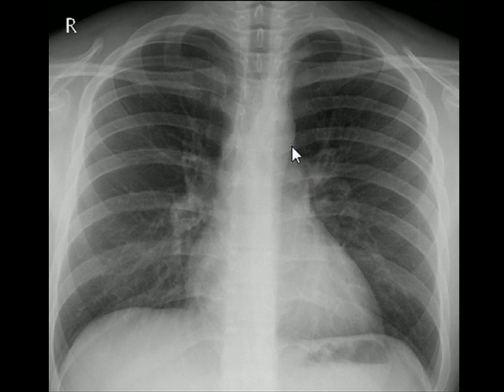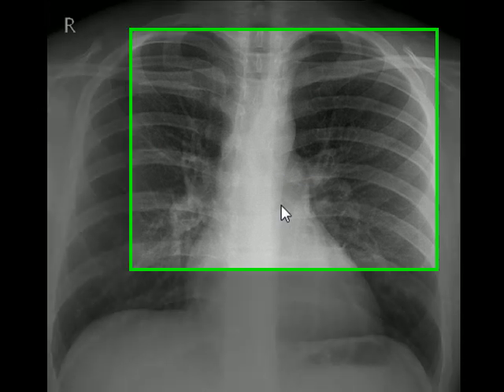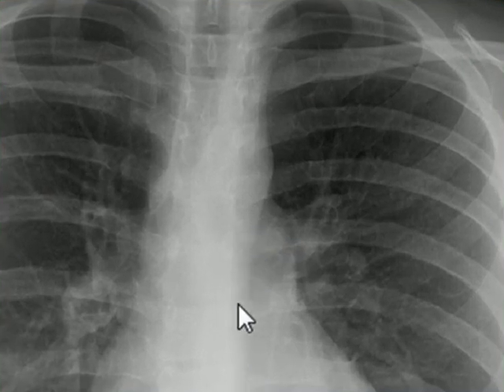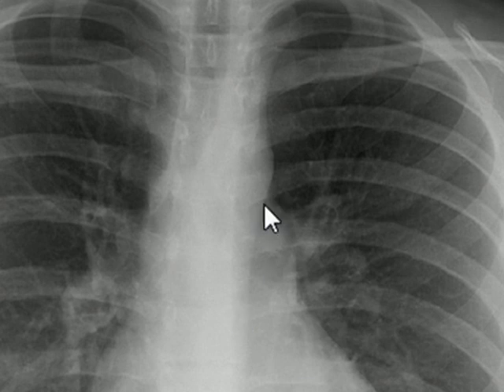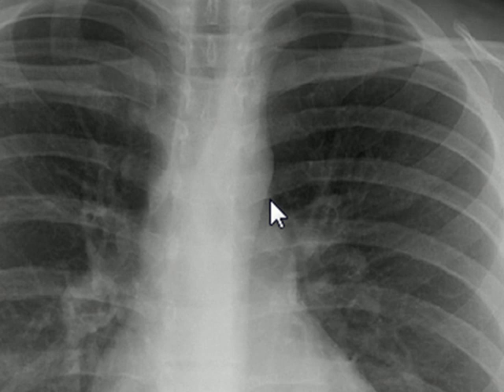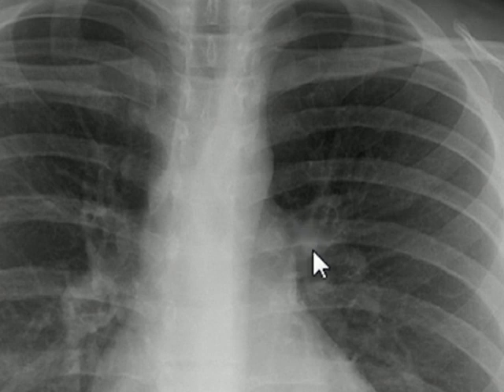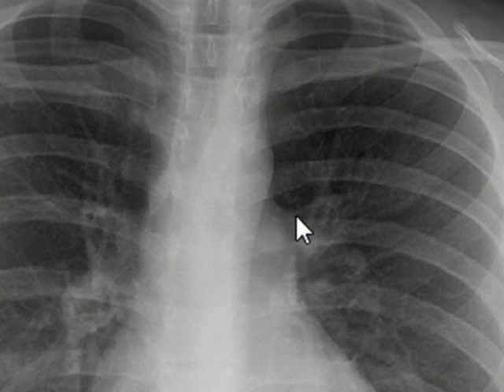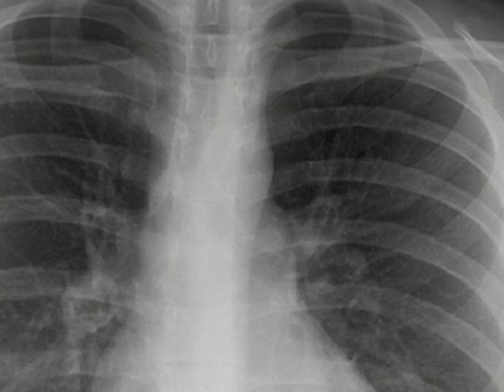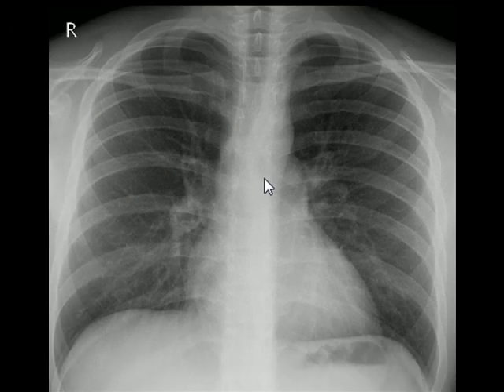This is the arch of the aorta turning into the descending thoracic aorta. This is the aortopulmonary window, which will disappear in the presence of any kind of mass lesion. This is the main pulmonary artery and this is the left pulmonary artery. The highest point of the left hilum is the left pulmonary artery as it passes over the left main bronchus. On the right side, the highest point is where the right pulmonary artery, right main bronchus, and right superior pulmonary veins converge.